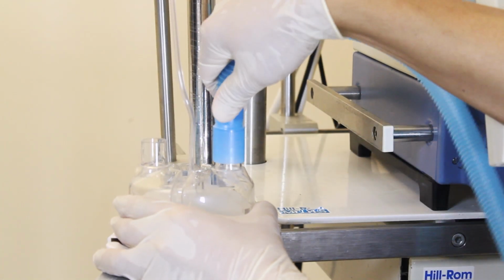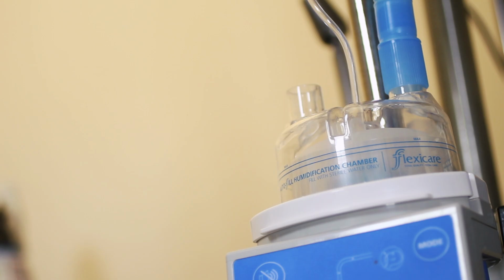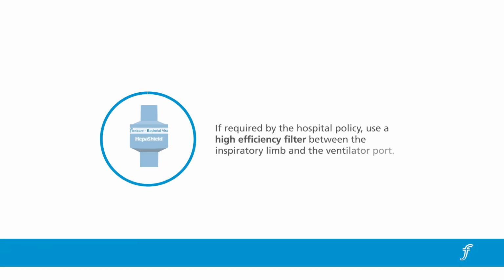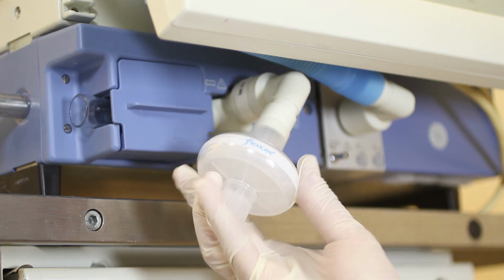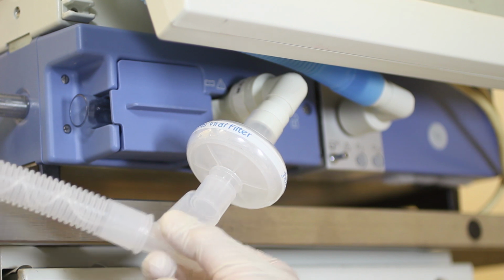Attach the short blue inspiratory limb to one of the chamber ports and to the ventilator inspiratory port. Connect the angled elbow of the inspiratory limb to the outer port of the humidification chamber. If required by the hospital policy, use a high-efficiency filter between the inspiratory limb and the ventilator port. To protect the ventilator, hospital policy may also require a bacterial viral filter on the ventilator expiratory port. Connect the angled elbow of the white expiratory limb to the ventilator expiratory port or expiratory port filter if used.